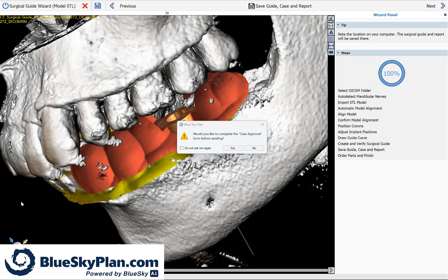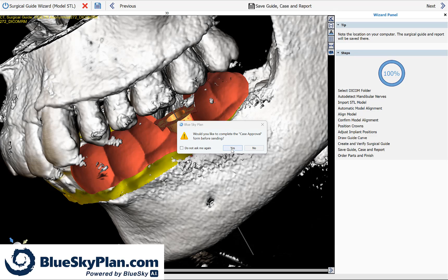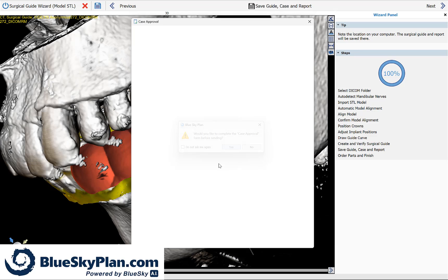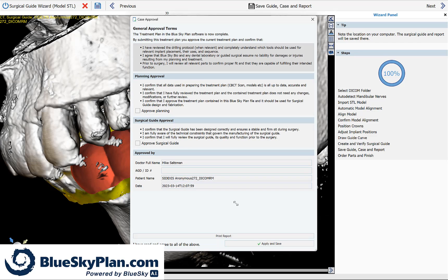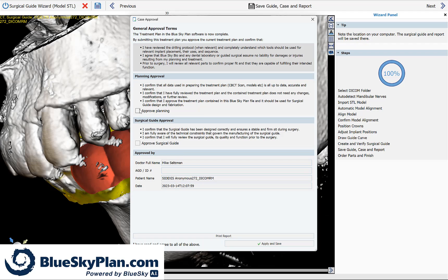The software is now asking if you would like to complete the case approval form. This is a form exactly for that, for case approval. So if you're going to be sending the case to a lab or to an associate and you want to approve the planning, simply click the relevant boxes and click apply and save.